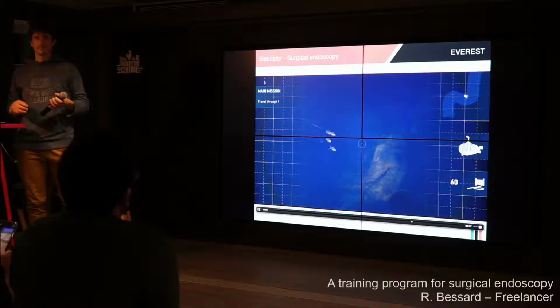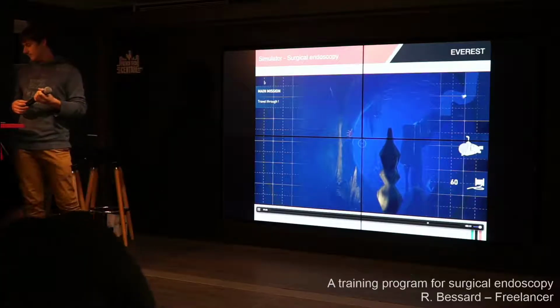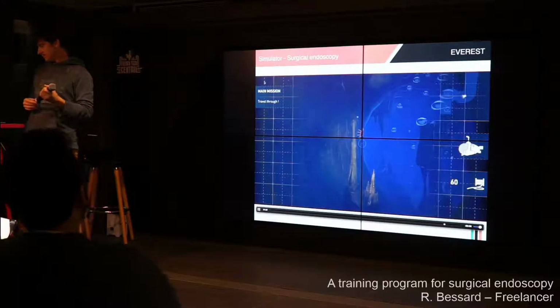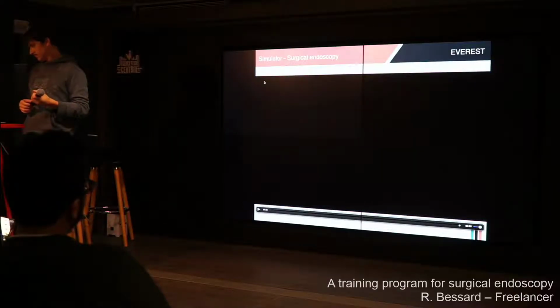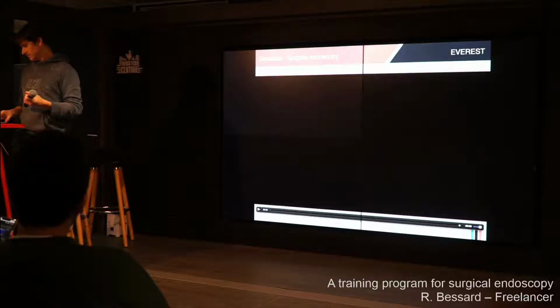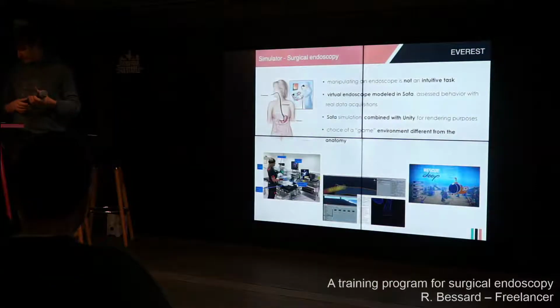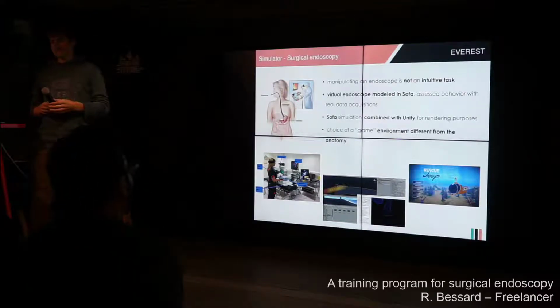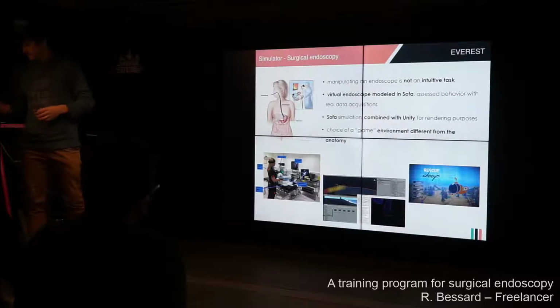So yeah, to again say that what you're seeing in the deep sea and so on was really a request from the surgeons. They wanted something which has nothing to do with the anatomy, because maybe they see too much of colon and anus all day long. But the purpose was really learning how to manipulate those endoscopes, because some people were coming to the hands-on training sessions on animals like pigs and so on, and they couldn't efficiently manipulate those endoscopes. So the idea is to have these new simulation solutions, like Rémi is presenting.